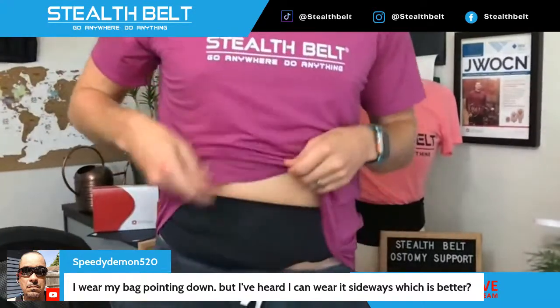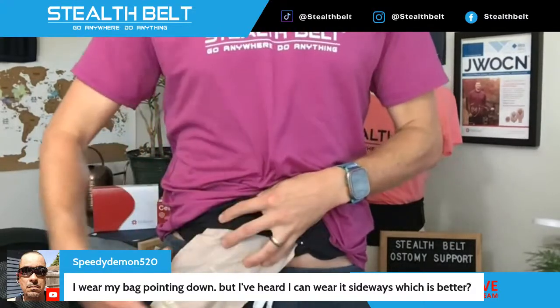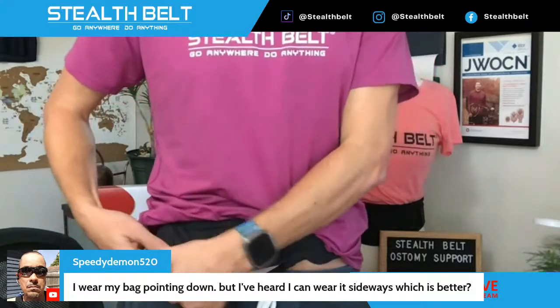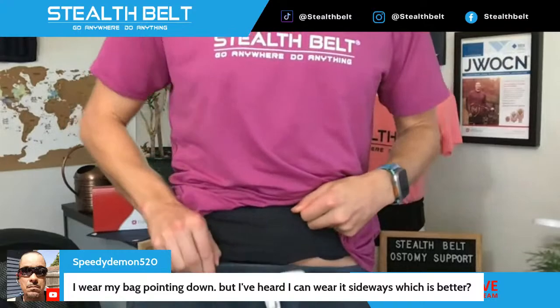Viewer question: I wear my bag pointing down but I heard I can wear it sideways — which is better? There's a subjective element here — I don't think one is necessarily better than the other; it depends on your situation. I personally like to wear the bag horizontally. The belt on my mannequin is designed that way. My appliance is actually worn at about a 45-degree angle, moved up into the belt and zipped up, positioned off towards the side.